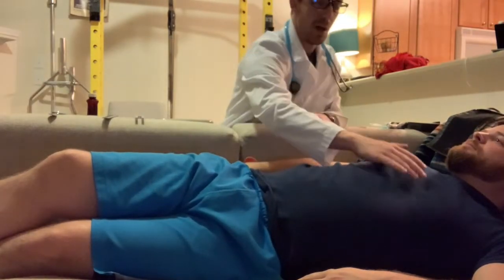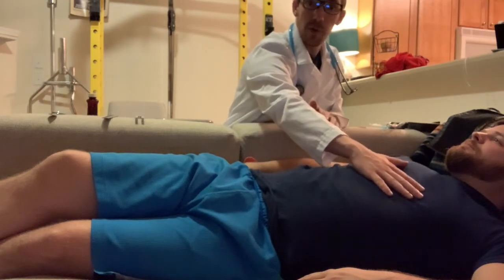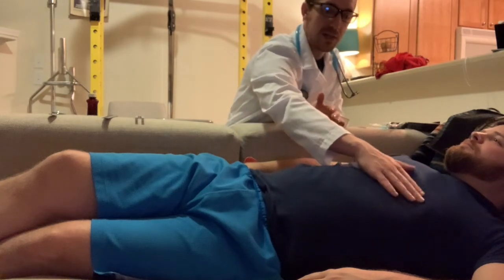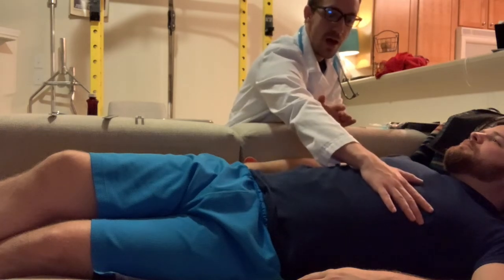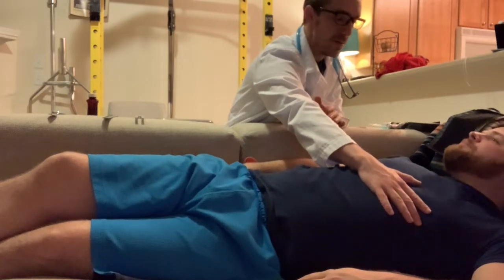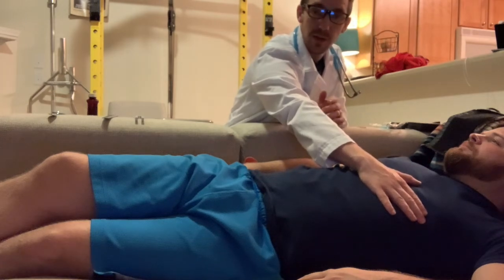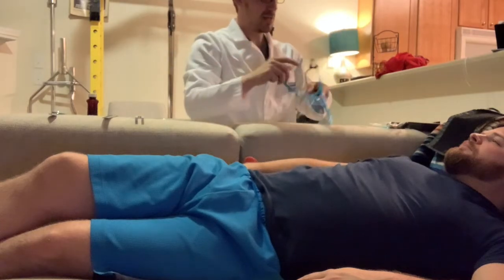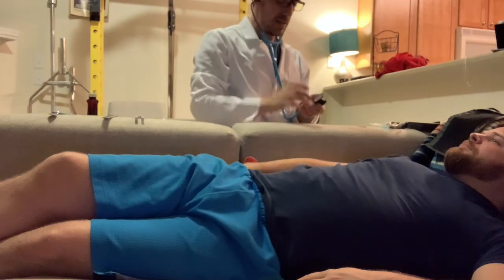So basically what I want to do is observe and palpate for any pulsations, any lifts or heaves. I want to be assessing for thrills. I want to palpate over the fifth intercostal space, or the point of maximal impulse, just to see if I feel anything abnormal. I can palpate the pulse just fine. I'm going to go into the listening portion of the chest assessment. I want to listen with both the bell and the diaphragm of my stethoscope.